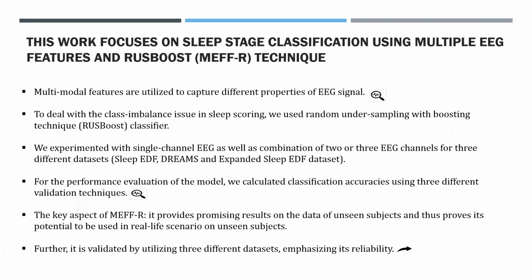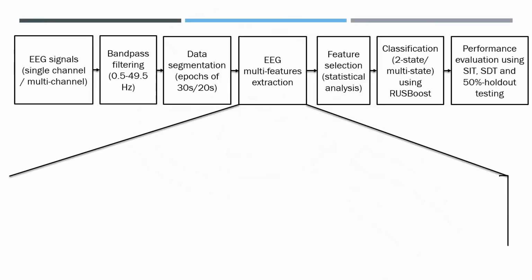Now, this work focuses on sleep stage classification using multiple EEG features and the RUS boost technique. We have derived multimodal features to capture different properties of the EEG signal. This is the workflow that we have carried out in this study.